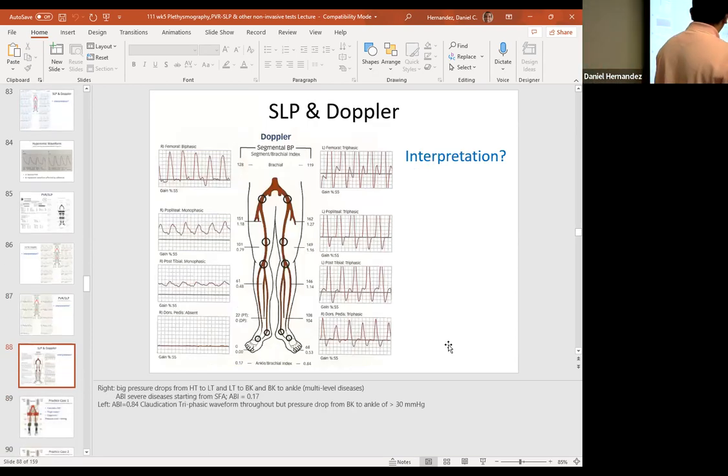So here's a good example. Are these PVR waveforms or are they Doppler waveforms? Well, on the left, there's a baseline. I would say on the right was Doppler. Well, I guess no, because it goes below the baselines. These are the baselines, these are the Doppler waveforms. This is just kind of hugging the baseline so you can't see it.